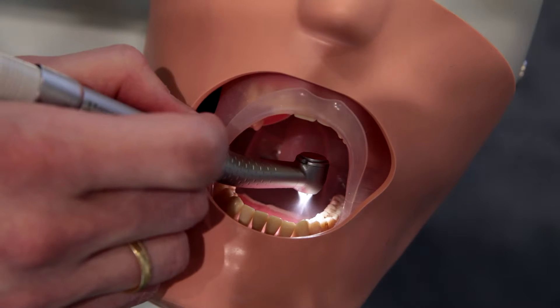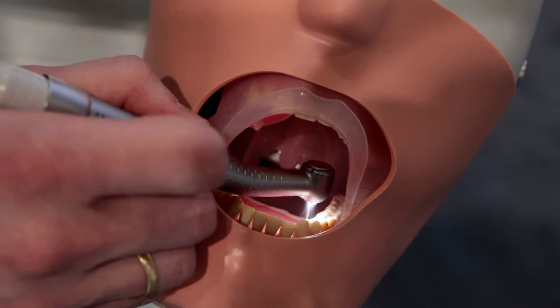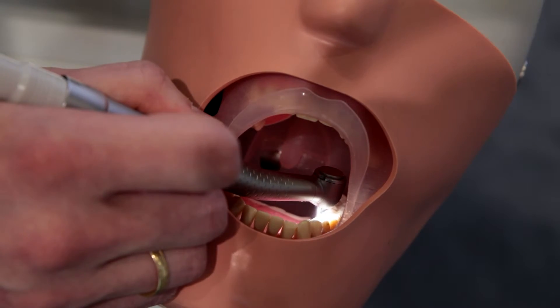The advantage of this is that you don't get the shadows that you tend to get with glass rod instruments. For you as a dentist, this means shadow-free illumination, in particular in the molar area and for preparations in the distal area of the molar.